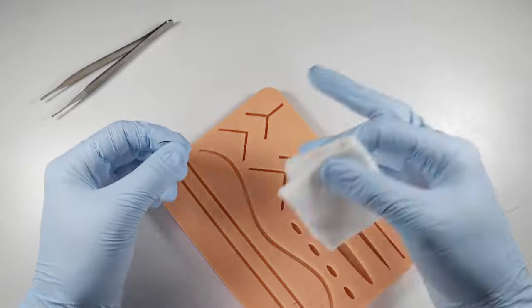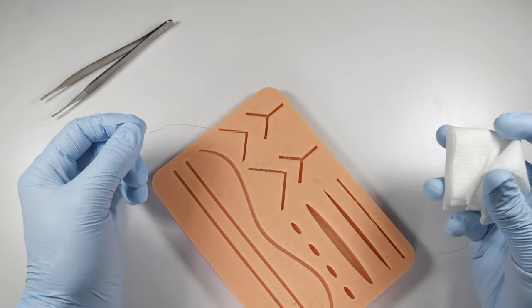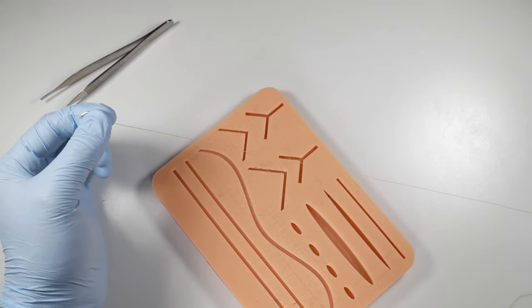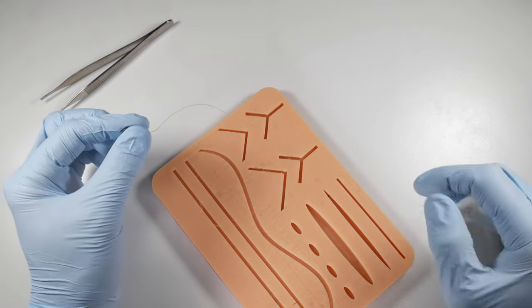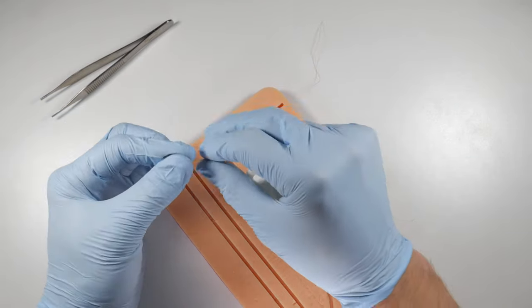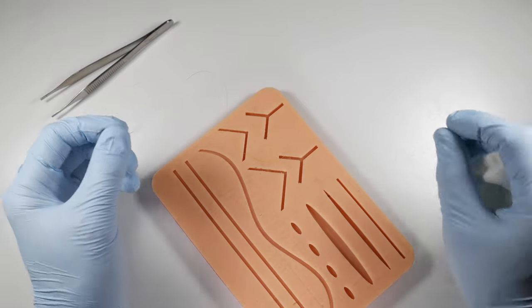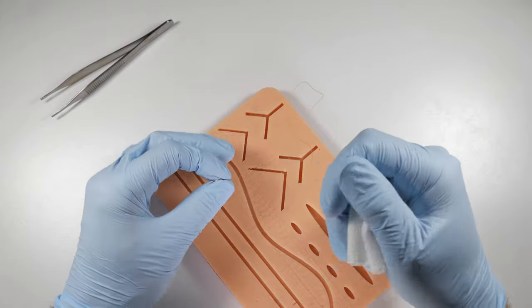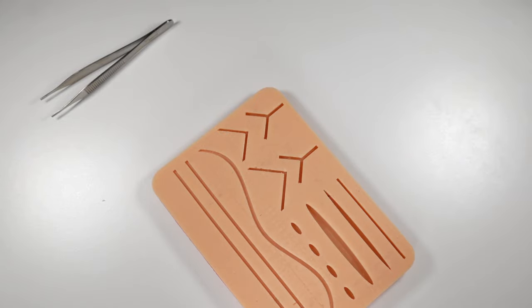If you've worked with this suture and it's been sitting on the tray drying out, same thing. Use a wet gauze to wipe any blood or residue off of there. Keep it nice and wet so that it's sliding nicely through the tissues. If this is dry, it's going to be sticking to the tissues. It's going to be hard to pull that through and it's not going to work quite like it was intended.